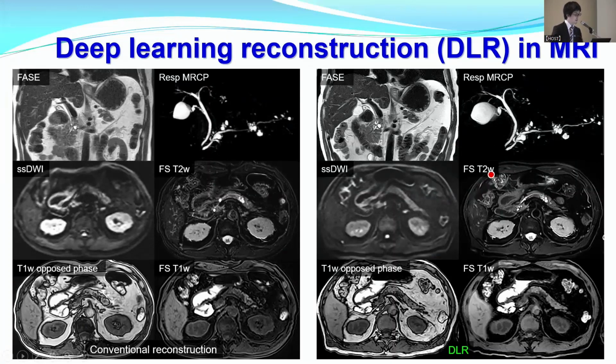You can see the images are substantially improved after the implementation of deep learning reconstruction. Today I'd like to show several clinical MR images with deep learning reconstruction.